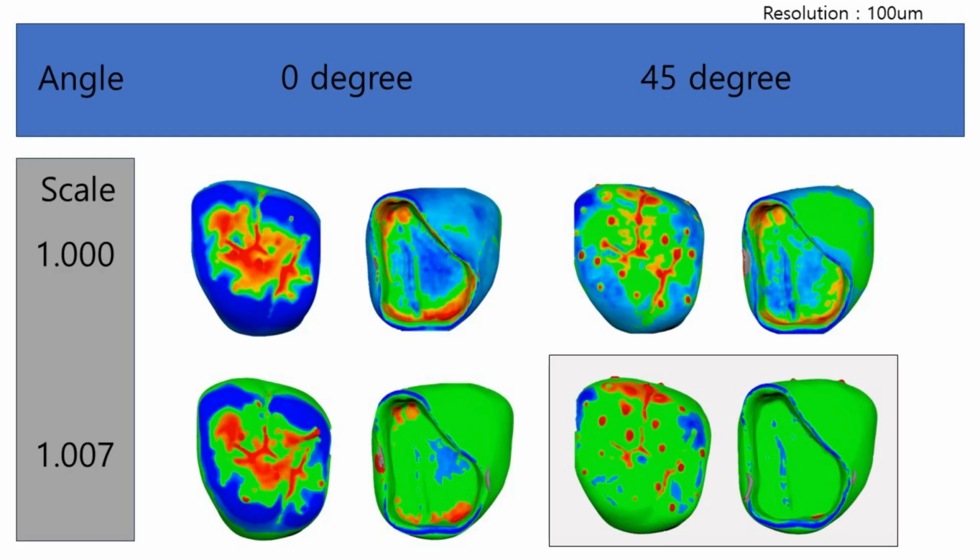We found that by adjusting the scale and angle, similar improvements in print outcomes could be achieved across different printers. Notably, the printer's functionality to automatically adjust the exposure time for each layer thickness worked effectively. Additionally, the absence of over-extrusion in the prints was particularly impressive.